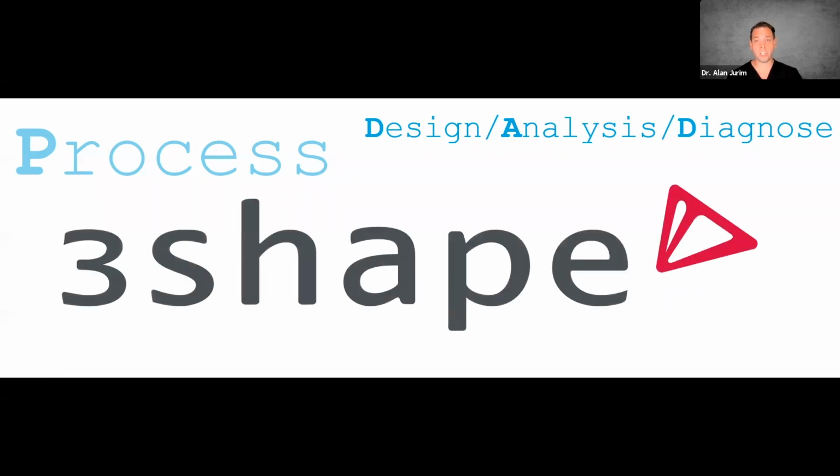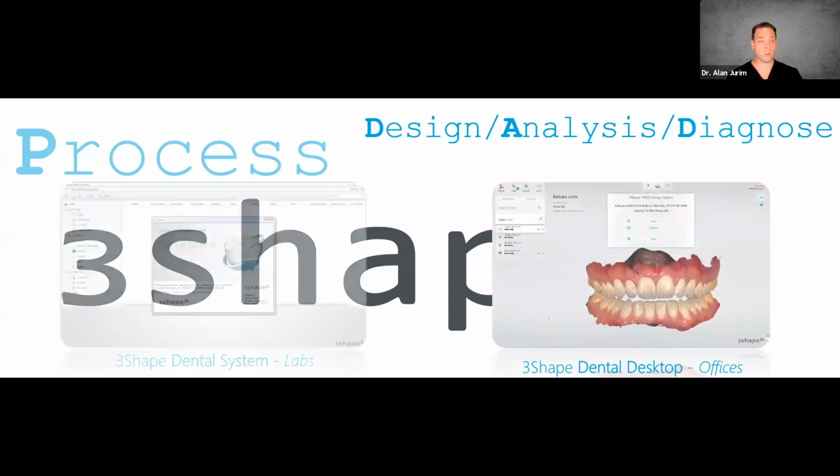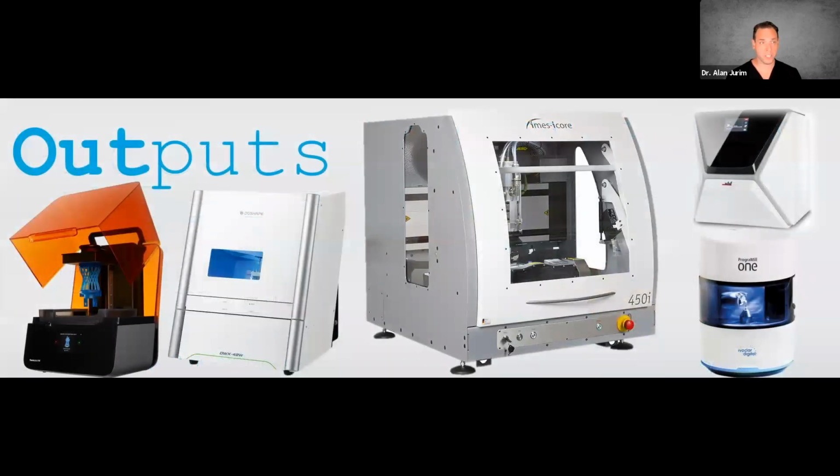Primarily, we use a lot of 3Shape technology for this aspect, for design, analysis, and diagnosis. We have the Dental Desktop application that comes with the Trios scanners, and this is the software that we use in the office to take the scans. We also use the Dental System, which is primarily made for laboratories, but what's really great is how the two softwares communicate. So once we've inputted, we're then going to process that information. We're going to use it for either a design to analyze or to help us diagnose, and then we're ready to output it. And the major outputs we have in digital dentistry are milling machines and 3D printers.